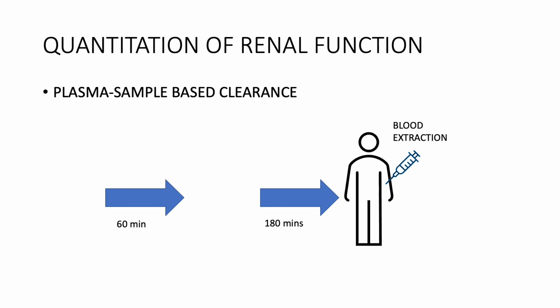The amount of activity remaining in the blood at these times is a measurement of activity not yet cleared by the renal mechanism and therefore is indirectly a measure of activity already cleared. This technique requires meticulous attention to detail and personnel expertly trained in vitro techniques. When performed correctly, GFR and ERPF measurements are theoretically more accurate than are those based on camera measurements.